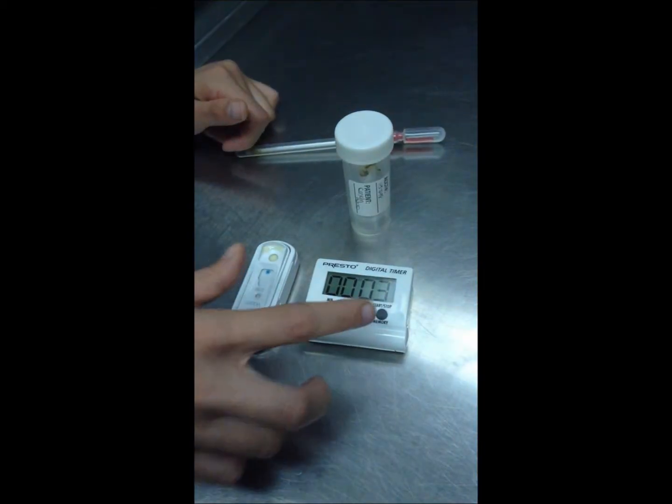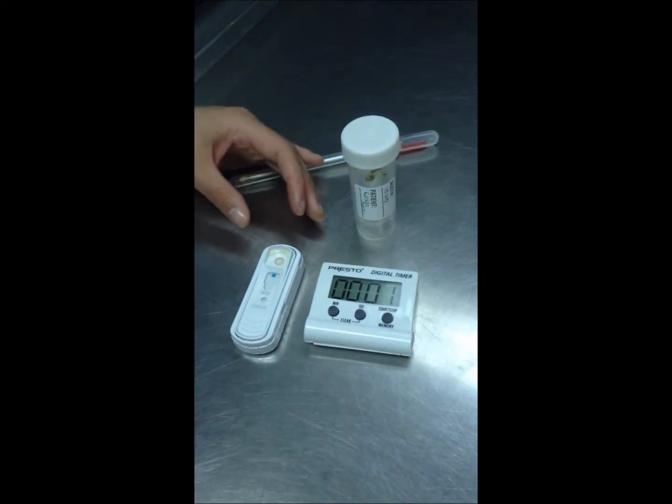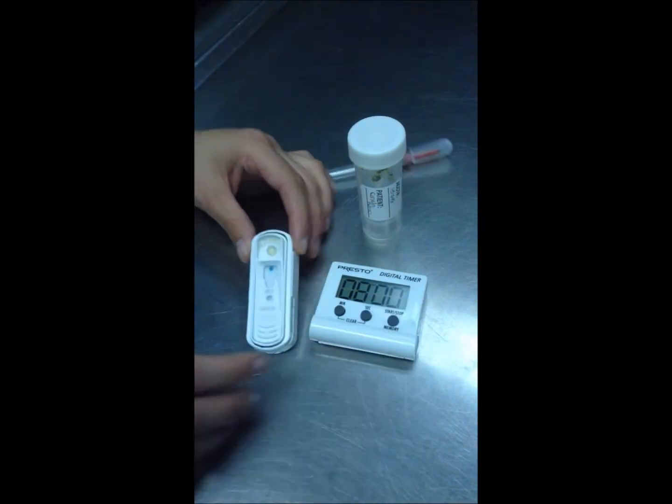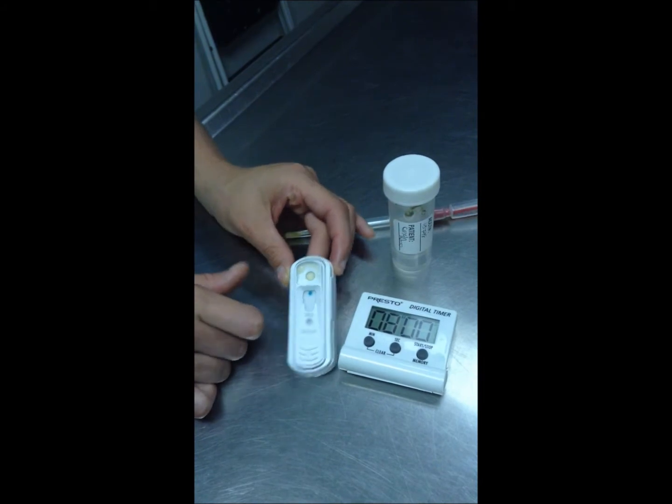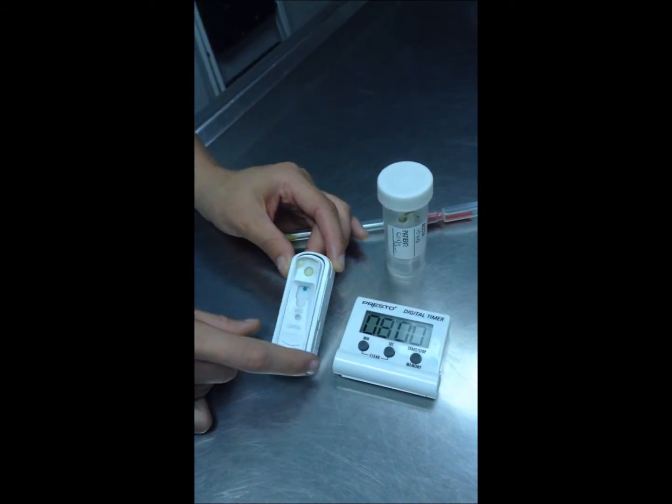So the results are almost done. We have 2 seconds left. There we go. And as you can see, there's only one dot. This is the control dot. So the Giardia test is negative for Giardia.